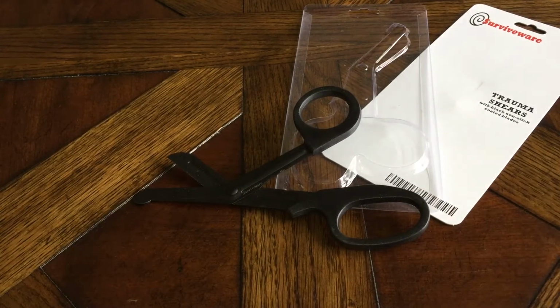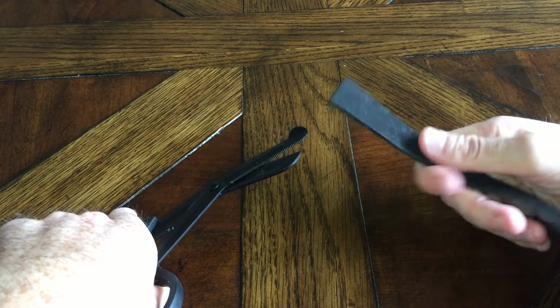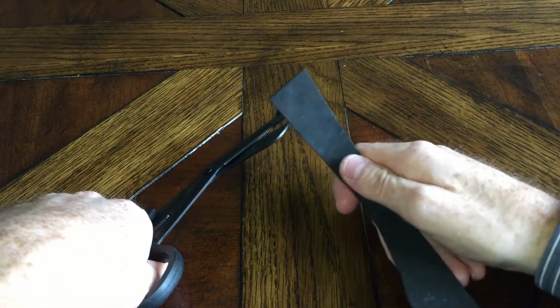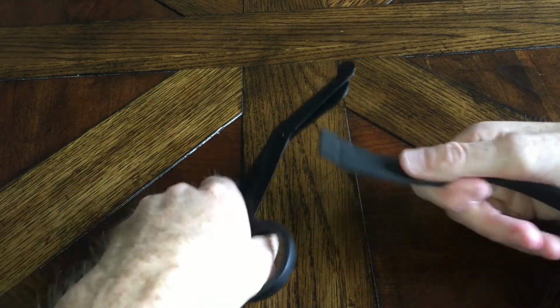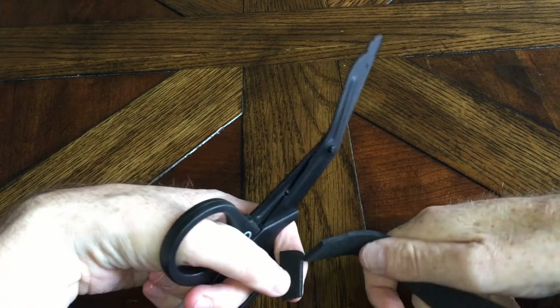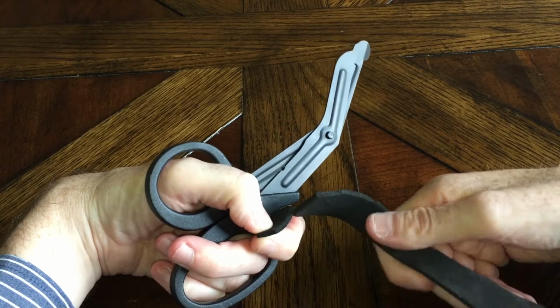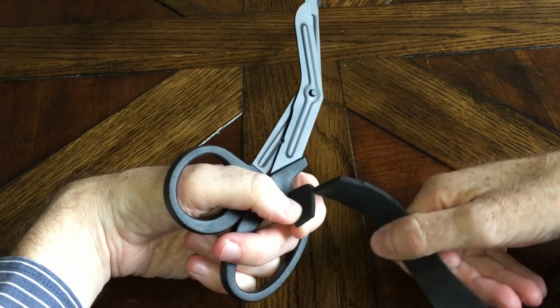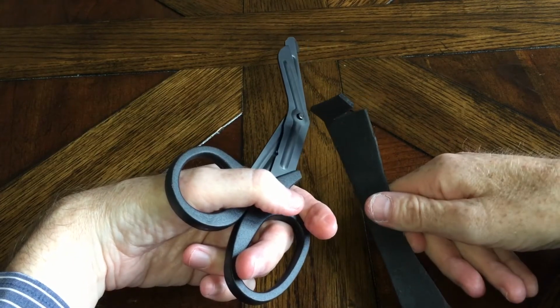So with that, we're going to try to cut through different materials. Here we're going to try to cut through just some simple thin craft foam. I'll just make one cut through it. And it's a nice clean cut. There's no burrs or edges where the scissors did not cut completely through. So we'll try another material next.